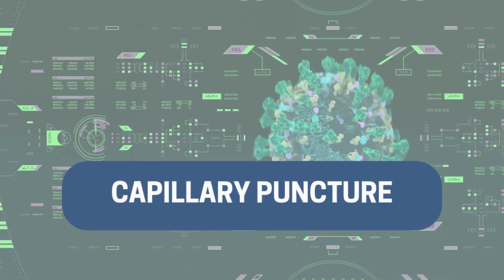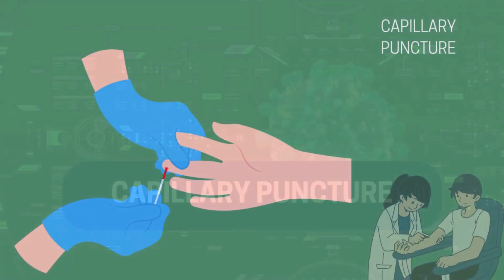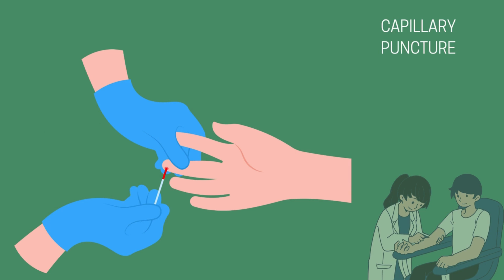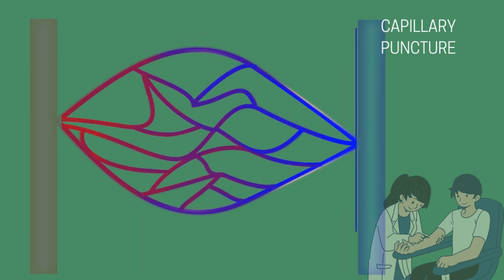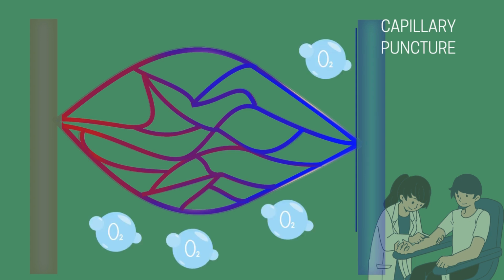What is a capillary puncture? Let's take a look. A capillary puncture is a method of blood collection that involves making a small incision in the skin, usually on the fingertip or heel, to obtain a sample from the capillary beds. Capillaries are found between the arteries and the veins and are the site where oxygen and nutrients are being dropped off and waste products are being picked up.